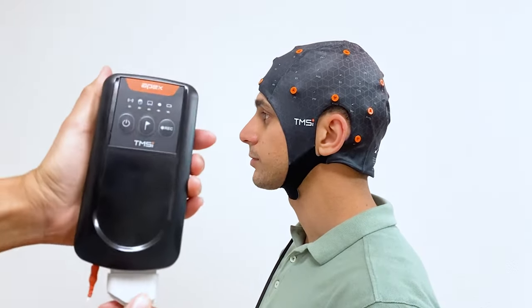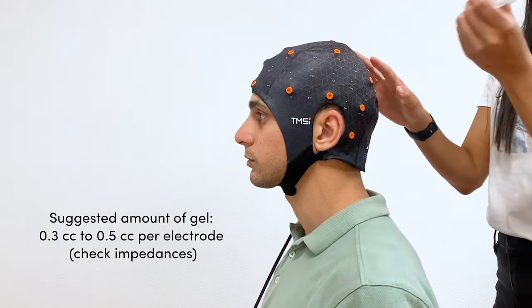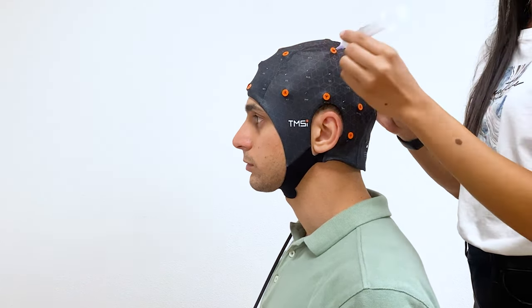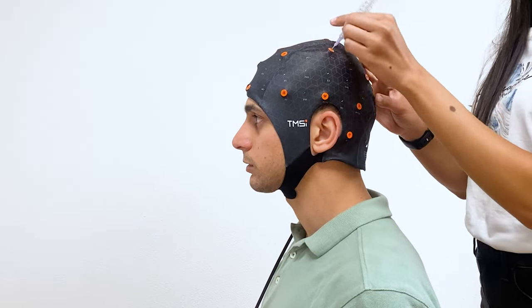Connect Apex to your PC. Using a blunt needle syringe with electrode gel, apply gel through the electrode opening. Rotate the syringe in circular motions to lightly abrade the skin and to evenly distribute the gel.